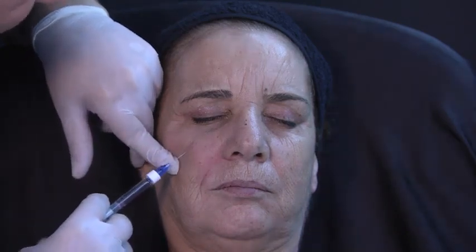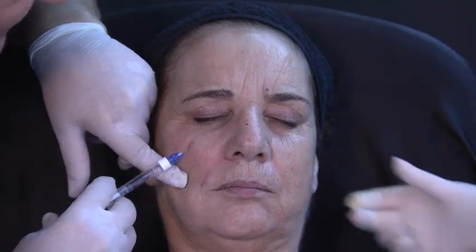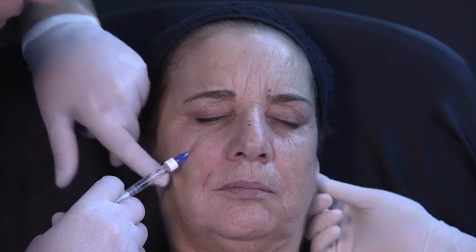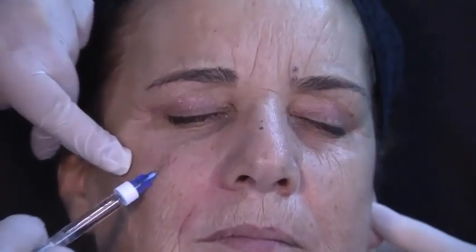Now I'm going deep on bone, and she will complain. Now, she doesn't complain because she's very nice. And I paid her a lot of money. And maybe it's the lidocaine you just did in the midface. Right, so now I'm deep, okay? And I am only going to inject a little bit.